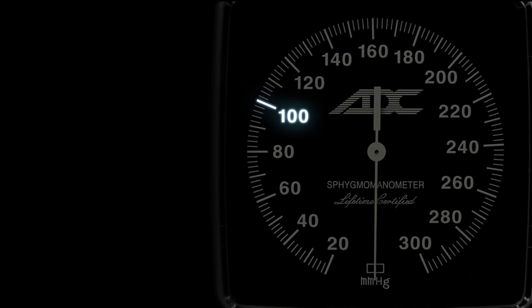Look at 100 and 120. The long line in between is 110, and the short lines equal 102, 104, 106, 108, the long line 110, short line 112, 114, 116, 118, long line 120. What do you think the number is just one line under 140? If your answer is 138, then you are correct.